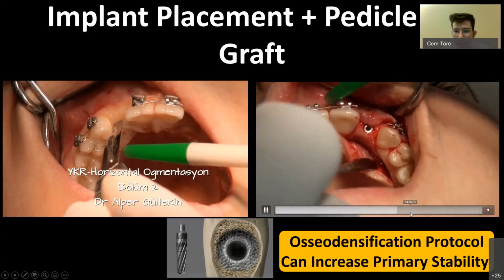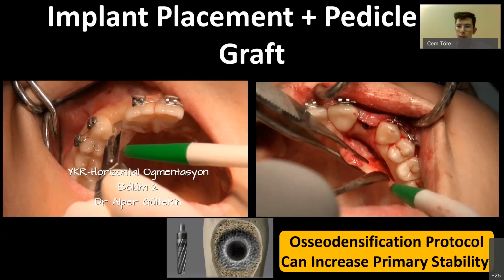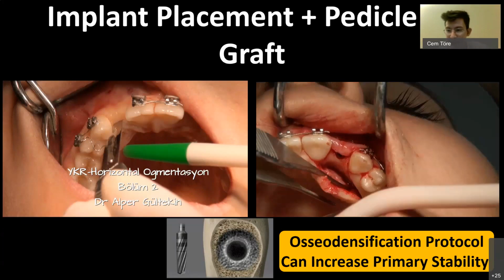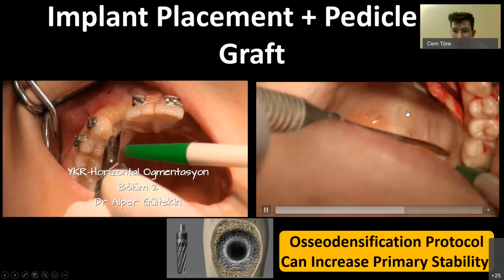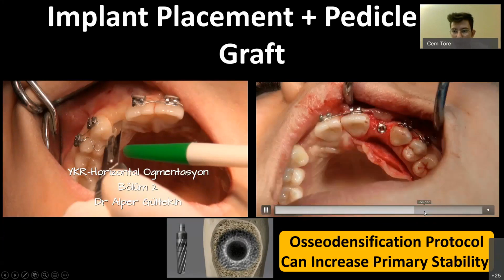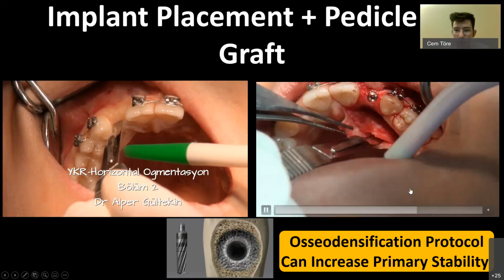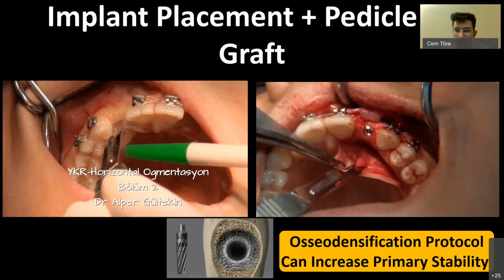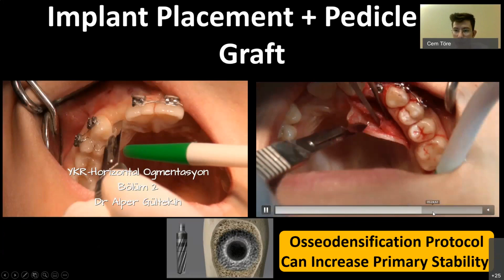We are making a partial thickness flap, or as I like to call it, cutting a fillet of connective tissue from there. Except for the pedicle, which connects it on the mesial side, which we will need for its blood supply. We are going slowly, making sure the blade does not come out from the palate. It's very hard to suture those once that's done, not impossible.